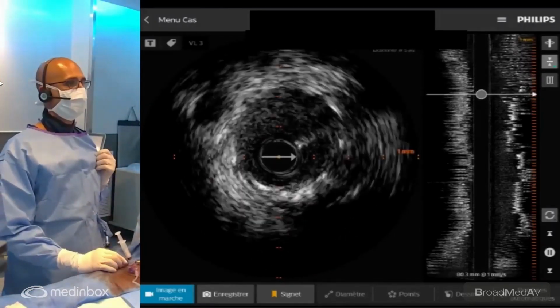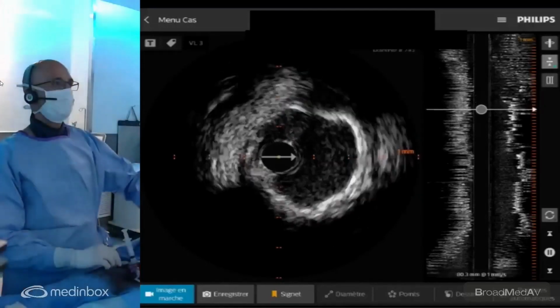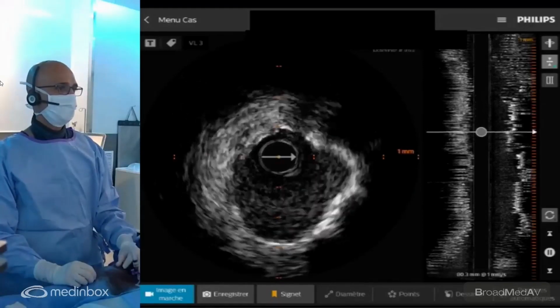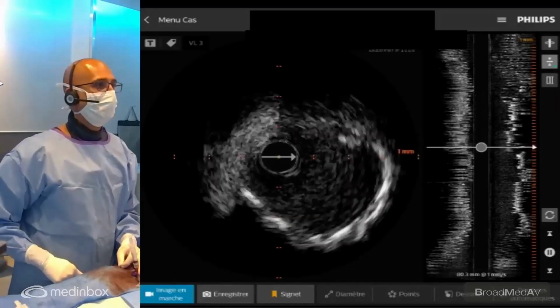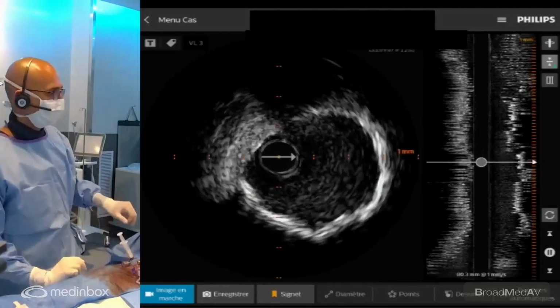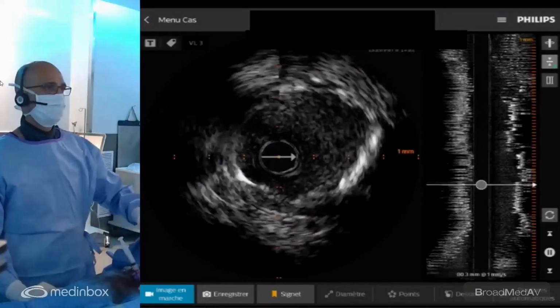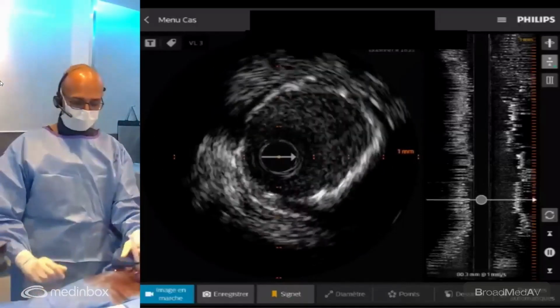Yeah, the flow is good. Okay, let's pull the wire. Very nice. So definitely better than it was at the beginning. Okay, let's go to LAO 30. Good. Good job. That's a pretty good result.